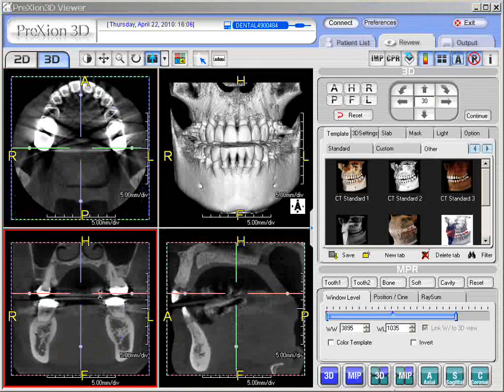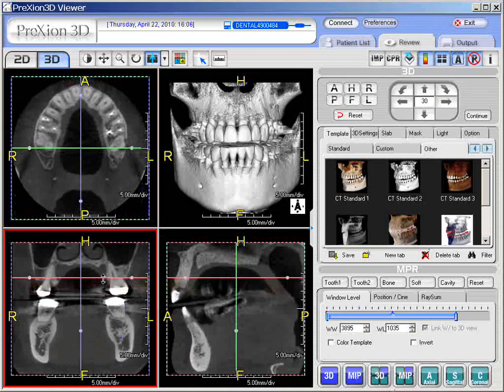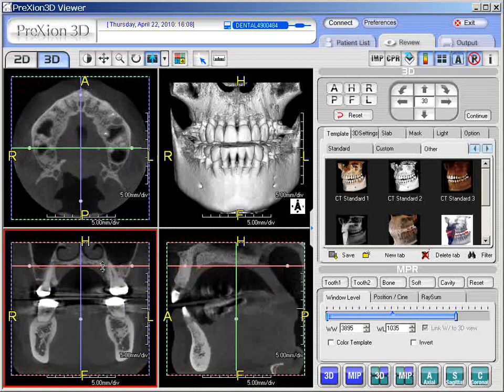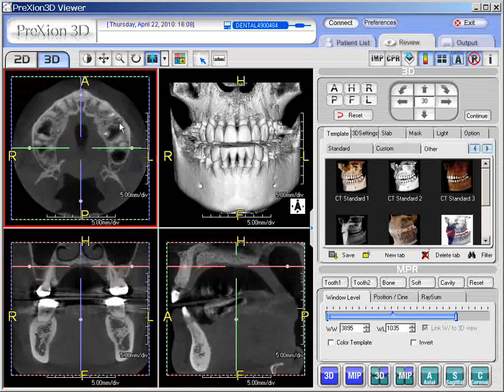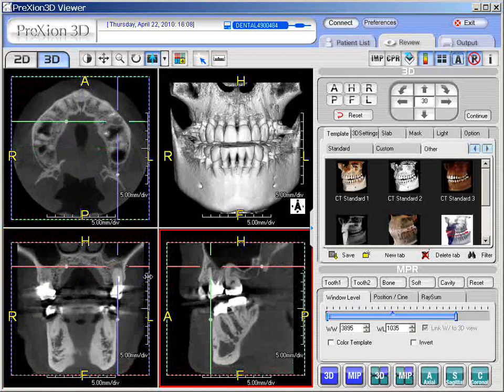Let's demonstrate a secondary area of concern using this technique. I'm going to grab the pink line and scroll up in the coronal and look in the axial projection. Here we see the root tips — specifically paying attention to the left side. Here is an area of suspicion and concern. Again, I'm going to press the Alt key, click it down right into that position. And here we have, in the axial, coronal, and sagittal projections, an area of suspicion — perhaps a cyst.